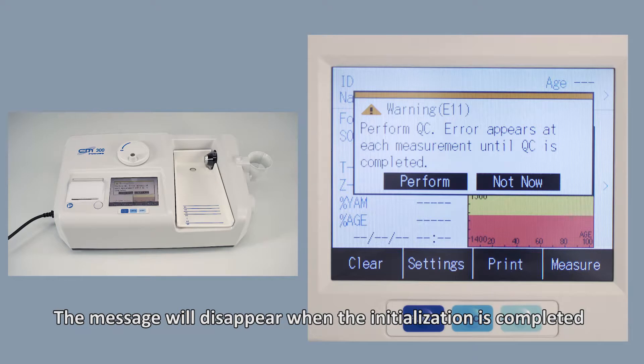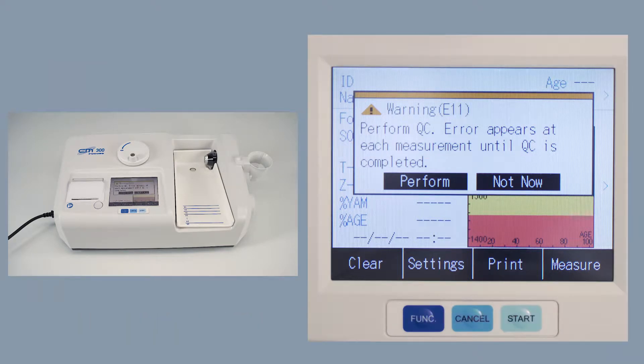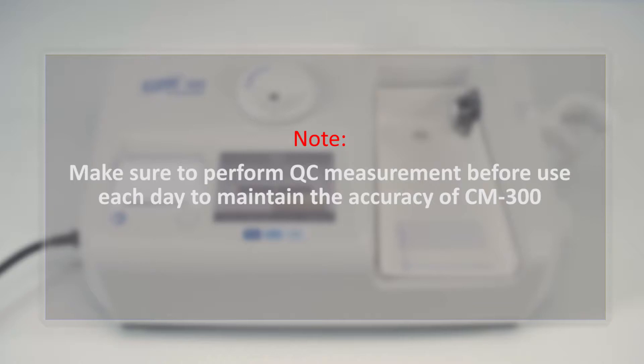After initialization, you will see a message requesting QC measurement. Make sure to perform QC measurement before use each day to maintain the accuracy of CM300. Tap Perform.